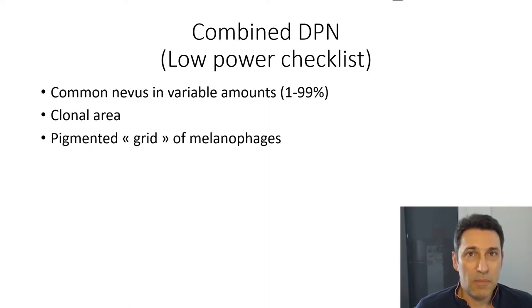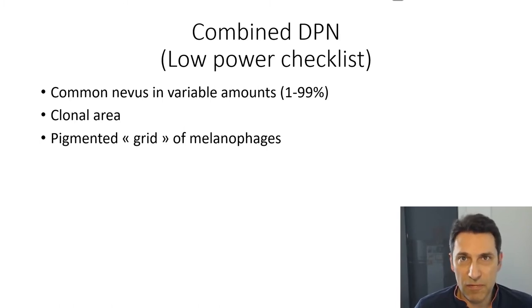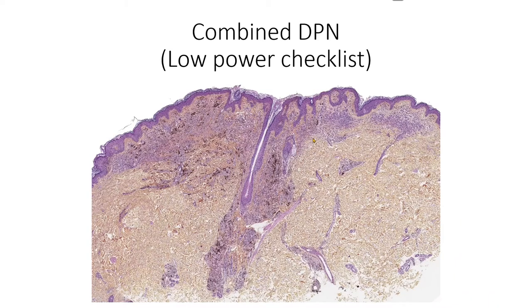Let's start with combined DPN. Here's a checklist for low power. You will be looking for an area of common nevus. You'll be looking for a clonal area, and in that clonal area, there will often be a grid of melanophages. Here is an example of combined DPN from one of my previous videos, with the nevus area, the clonal area, and the pigmented grid of melanophages.